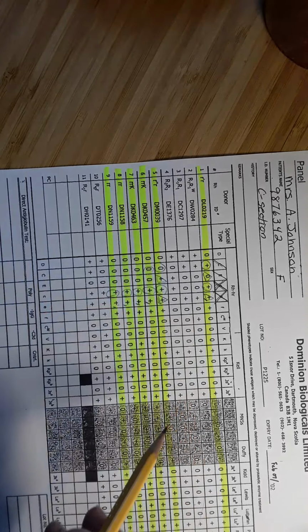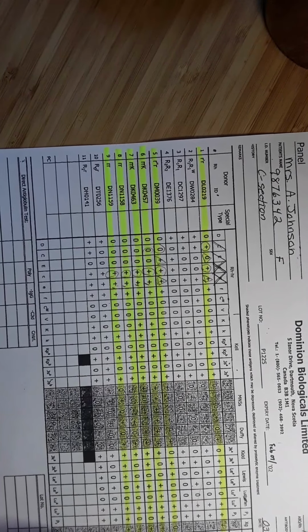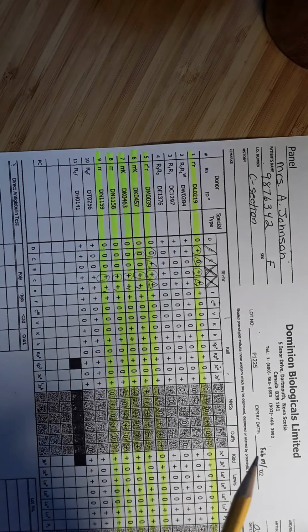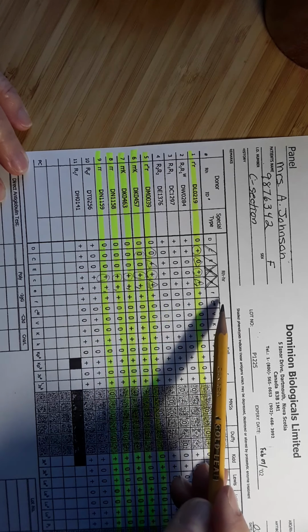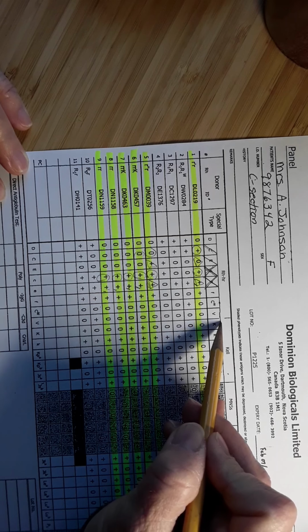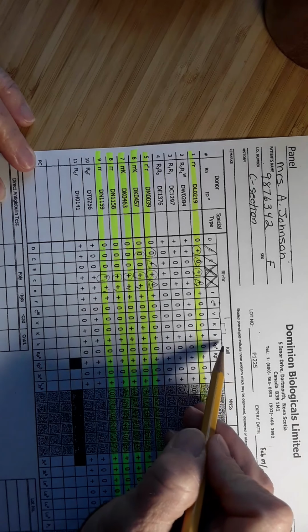I'm going to let you continue across, but I'm just going to give you a little bit of information about the allelic pairs because it's important to know what the pairs are. Otherwise, you can't look and determine if the cell is heterozygous or homozygous. So if we continue along, there is no allelic pairs for F, Cw, or V. And you may or may not know that big K and little k are an allelic pair.